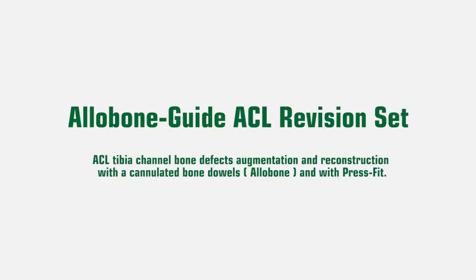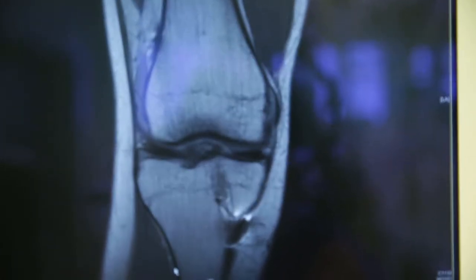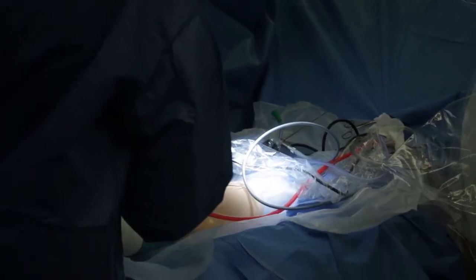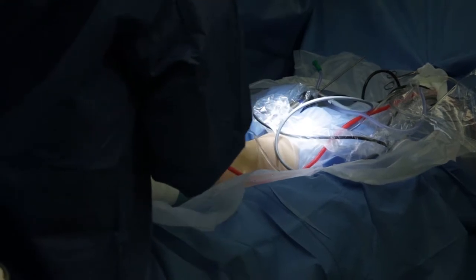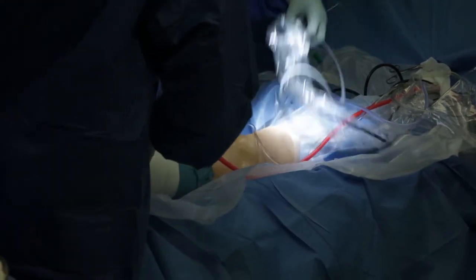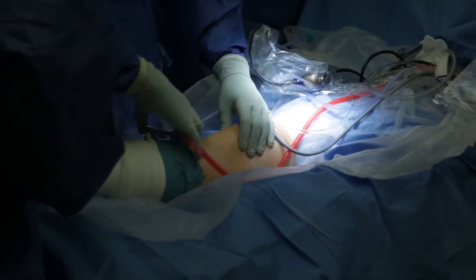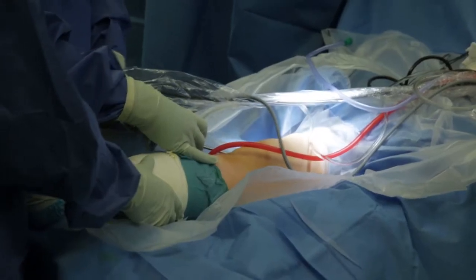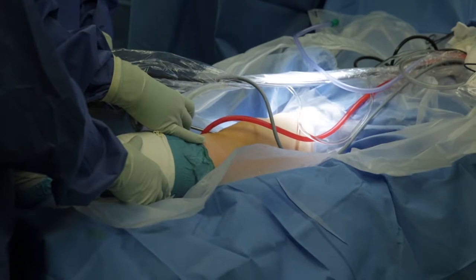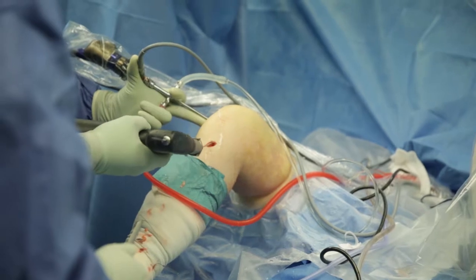So the Allobone-Guide ACL Revision Set is constructed for easy one-stage revision ACL surgeries. This case has an enlarged tibial channel, so we do ACL revision in one stage with filling of the bone defect at the tibial site. Usually this is a two-step procedure with a long time interval between those. So this is a one-step procedure.